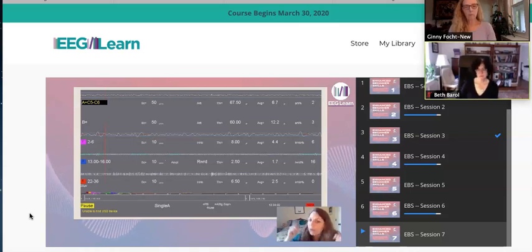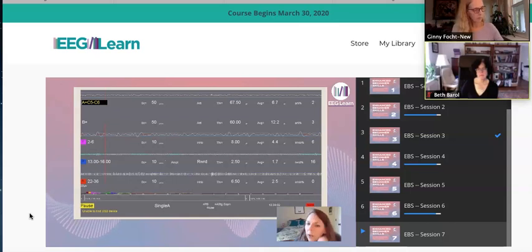And that would mean that these two sites are differentiating their activity. So our inhibit thresholds are going to be like a ceiling that we don't want the activity to go above. And then we have to really set our hurdle, our reward threshold. Since they have so little difference in that frequency range, we can't set the hurdle too high.